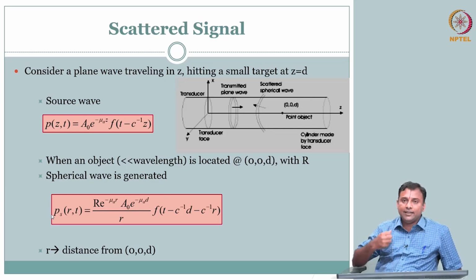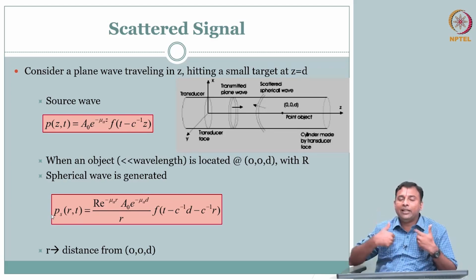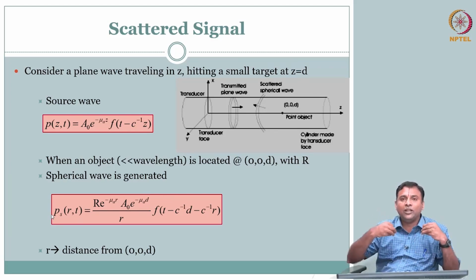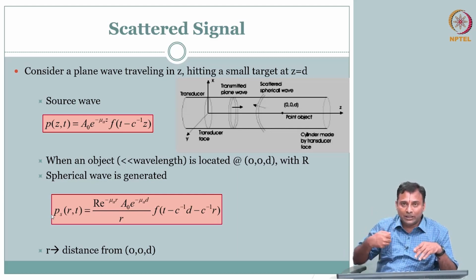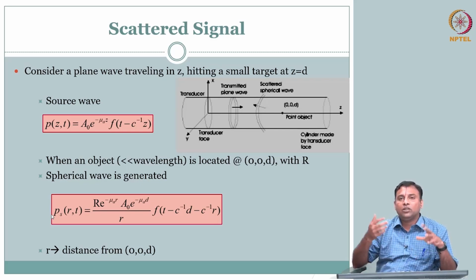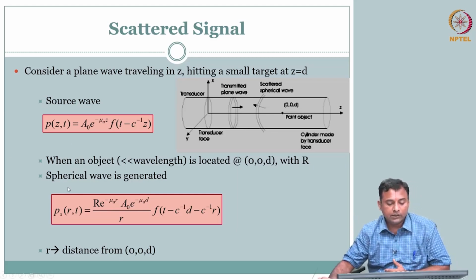So the whole idea here is I send a sound signal that gets bounced back because of the material property, how the material is distributed, how the acoustic scatterers are distributed in the body. Based on that, I get my echoes back. I send the acoustic pulse, I get echoes of that pulse. So typically we operate in what is called pulse echo ultrasound imaging. This reflected or scattered signal, whichever you get, is the echo. This is how you can write that.